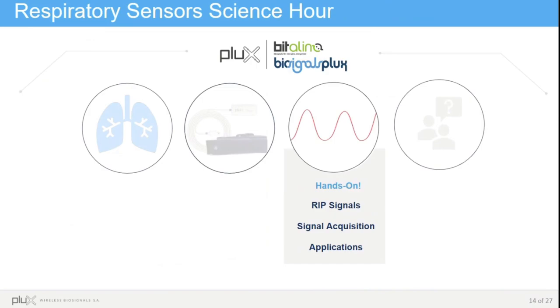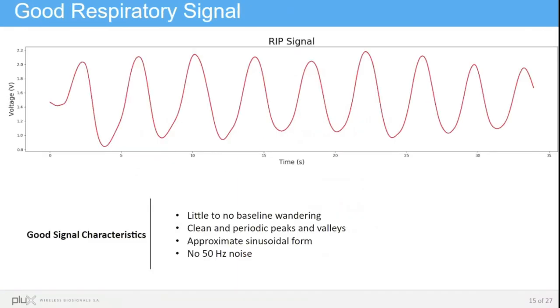Now Katrin will present some good quality signals and some bad quality signals. Looking at a good quality signal: as we can see in this plot, there is little to no baseline wandering, which means there are no shifts parallel to the x-axis. We can see clean and periodic peaks and valleys, an approximate sinusoidal form of the signal, and as the bandpass filter filters all frequencies above 1 Hz, we do not have any 50 Hz noise in the signal.